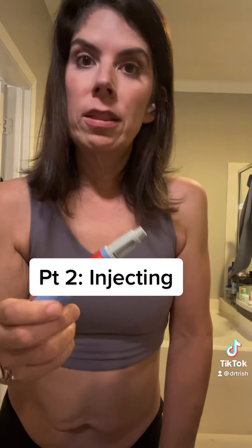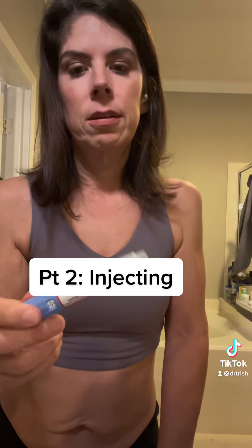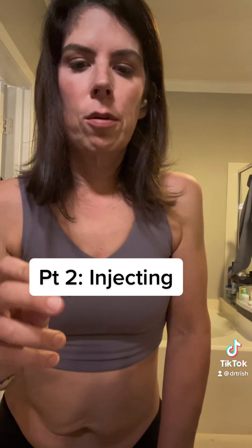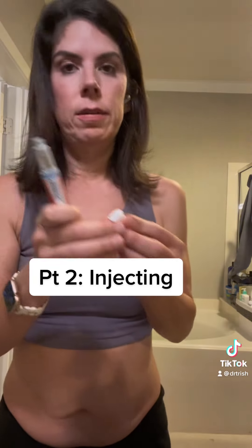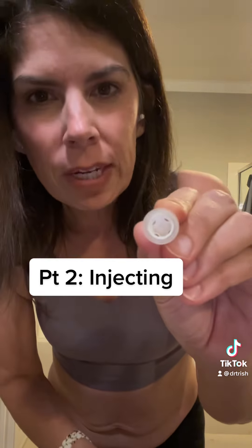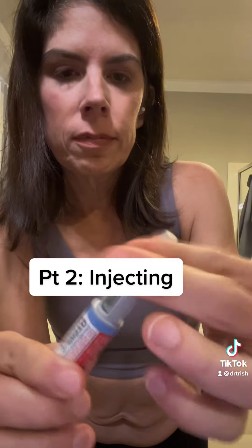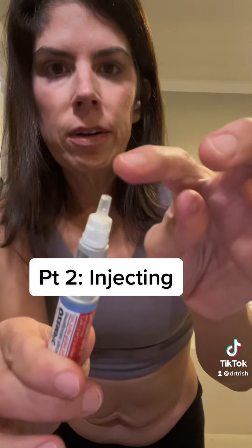So let the medicine thaw out for 30 to 60 minutes at least. This Ozempic pen is not as much of a concern because it's such a small quantity of medicine, so I don't usually let it thaw out. With clean hands, attach the little needle — this is a BD Ultrafine needle. It twists on, and you take off the first cap; underneath is the needle.